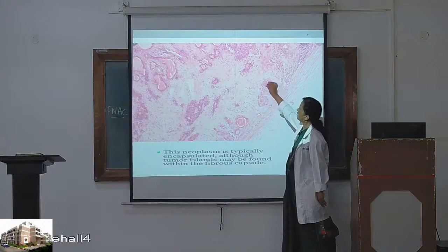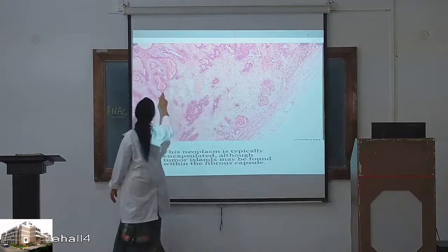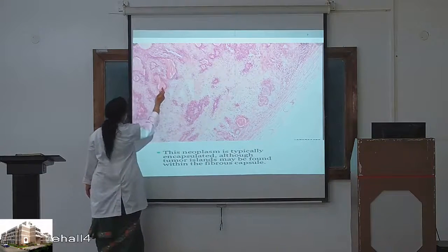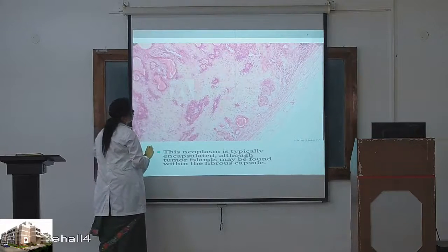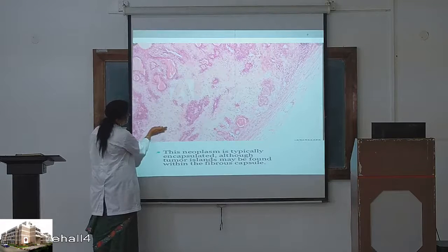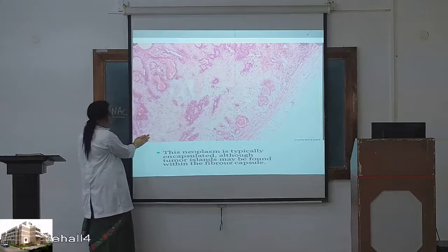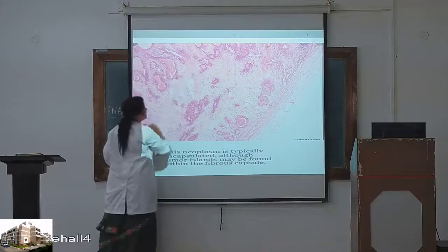All these are epithelial proliferation. See, so nicely the epithelium has proliferated. These are cyst-like structures. The ducts are dilated. They have eosinophilic material, that's the secretion. These you can say are hyalinized areas if they are more pink. This looks more like a hyalinized area.